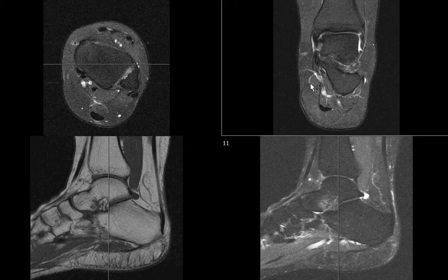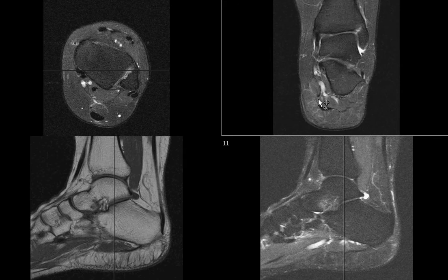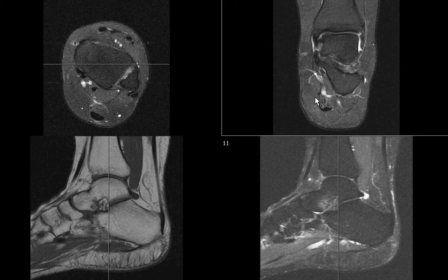That might be true of some other things — maybe abdominal imaging or brain — but in the musculoskeletal system we have to orient our planes according to the axis of the joint.